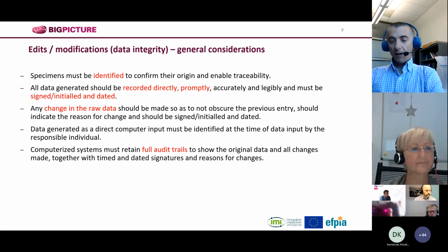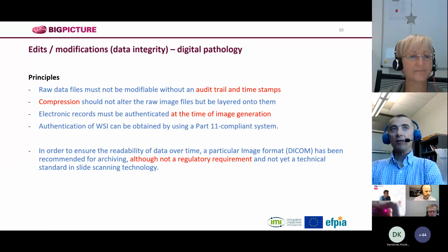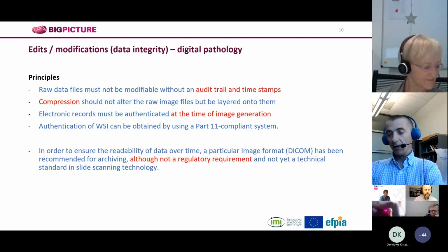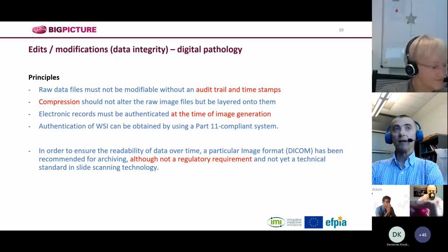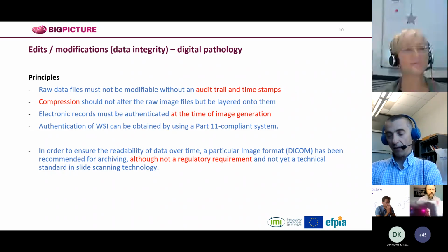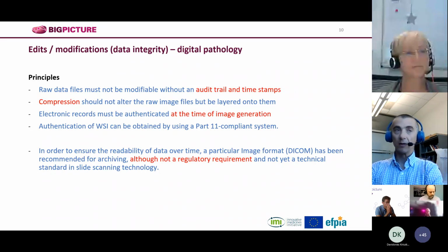So regarding whole slide images, this principle of data integrity is also a key component when we'll be inspected using these whole slide images in a GLP context. This is precisely what the inspectors are going to dig into. They will want to make sure that we can reassure the public who trusts us to test our compounds that we have preserved the data integrity all along our evaluation.